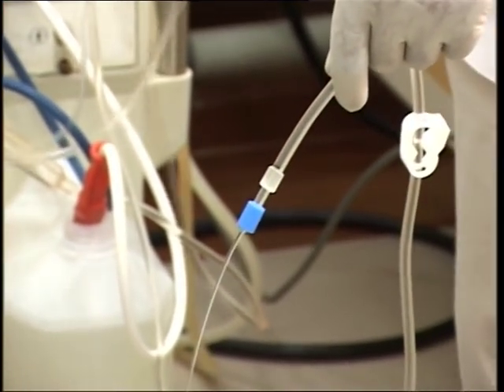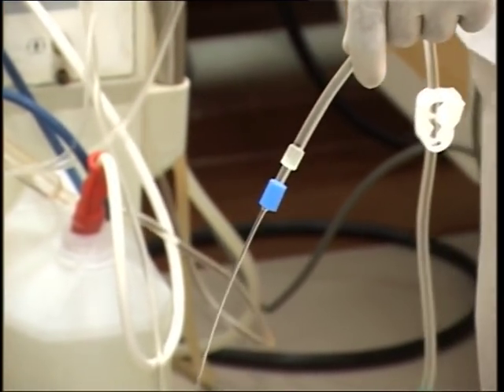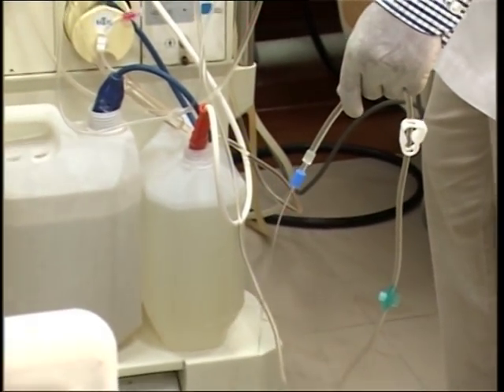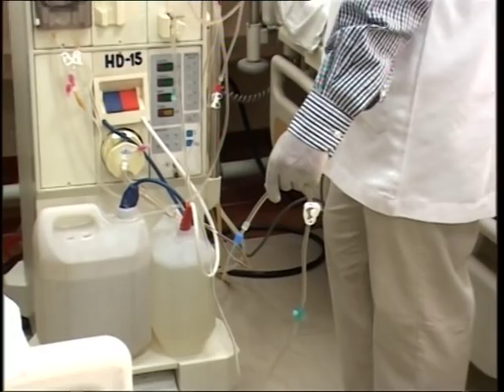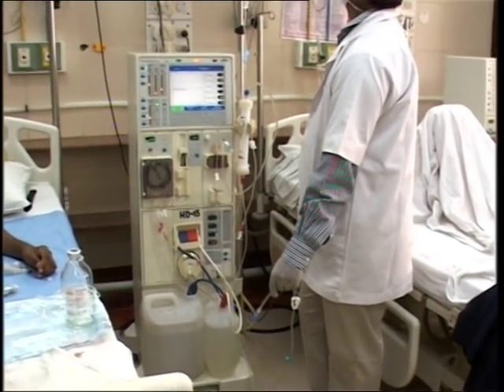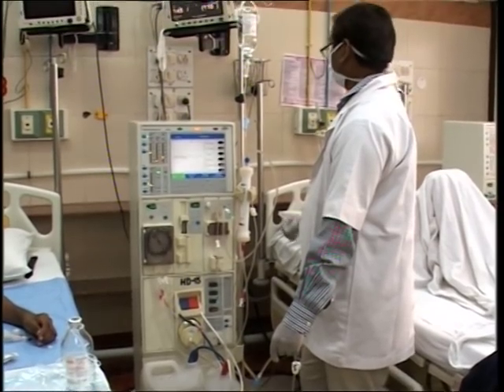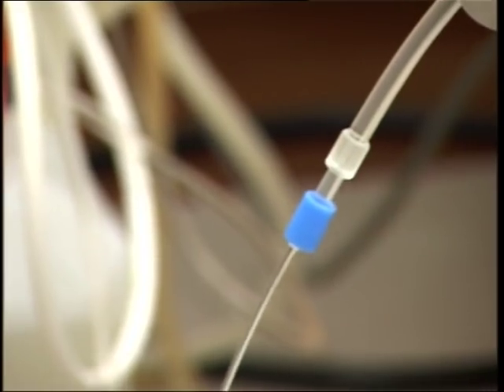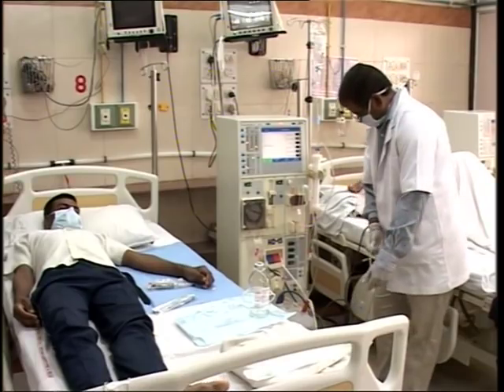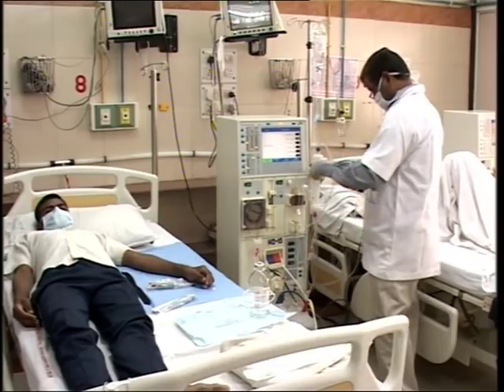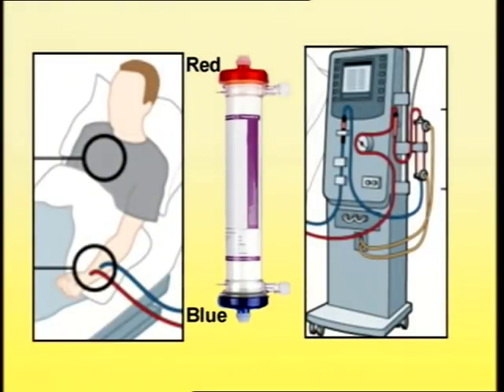At this point, it should be noted that the dialyser is inverted so that the venous end — the blue end — is on top, and it is gently agitated to remove all the air trapped in the circuit. Once the procedure is complete, the dialyser is again placed on the holder with the arterial end, the red end, up.